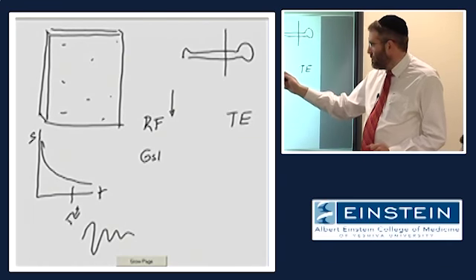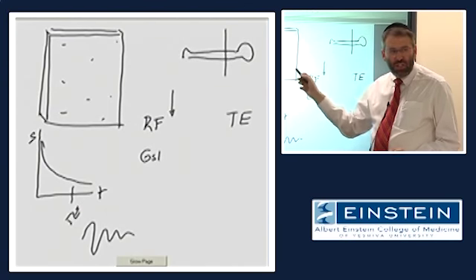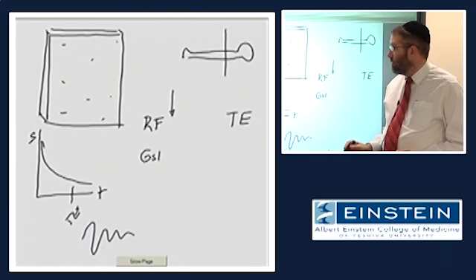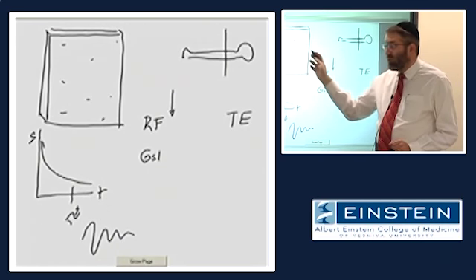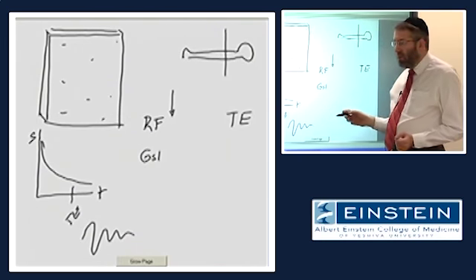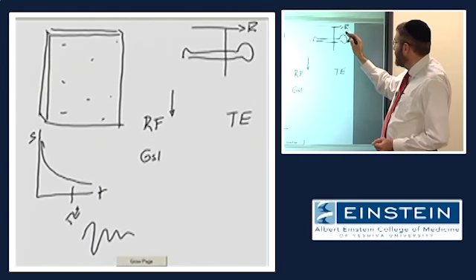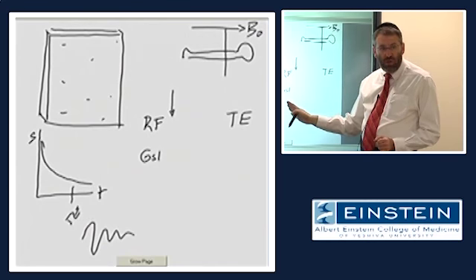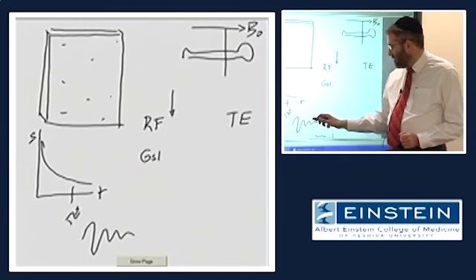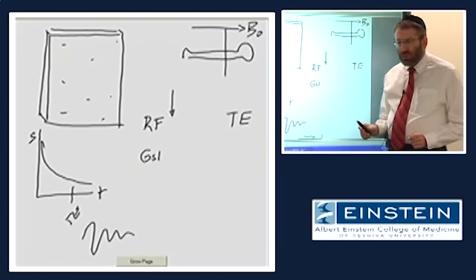Okay? At this point in time, what is the frequency of precession of the spins in the slice? On the left compared to the right, top compared to the bottom, it's the same, right? The entire slice at this point is only experiencing the static magnetic field strength B naught. The gradient has been turned off. So everything that is giving us signal, this signal here, is expressed by spins that all precess at exactly the same frequency.